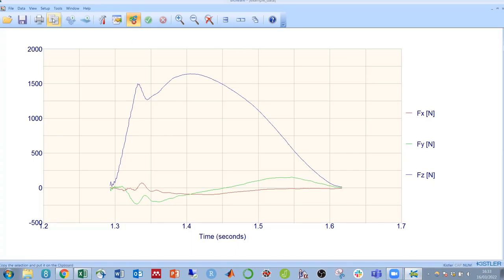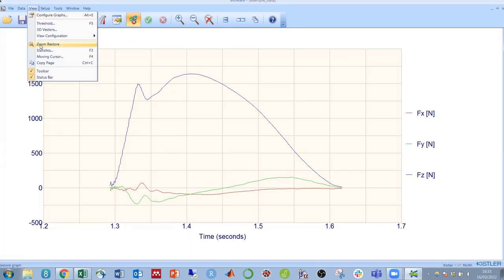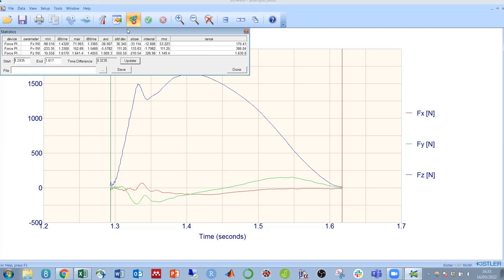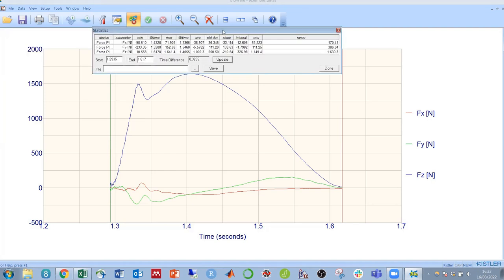To analyze the graph, we will need to click view and then statistics. This brings up a box of values, all of which are calculated between our start and end points.